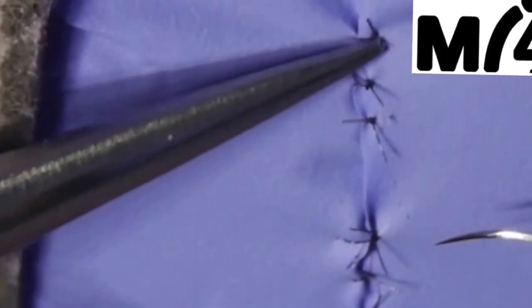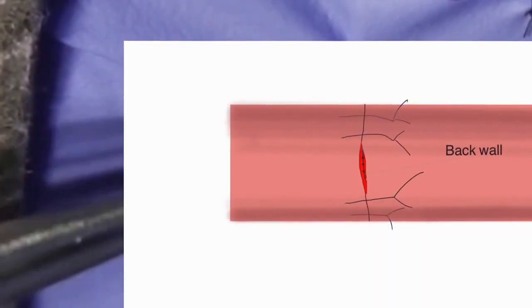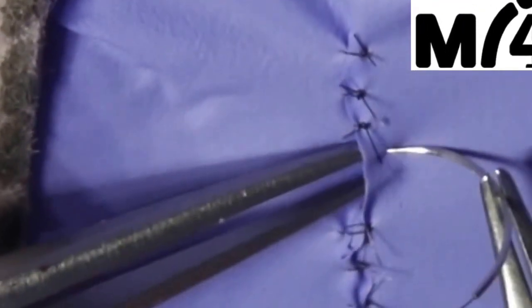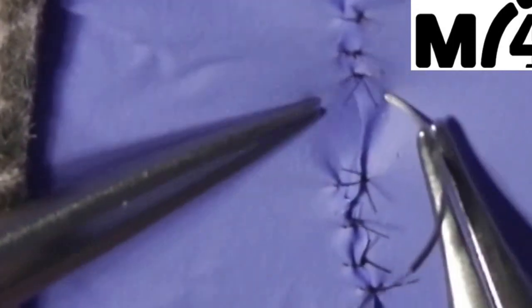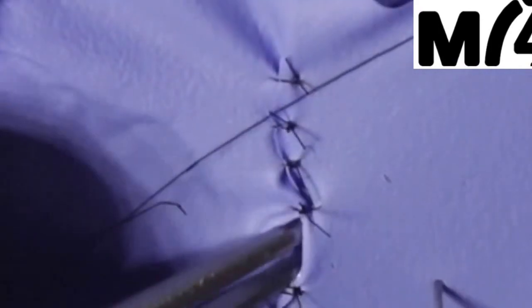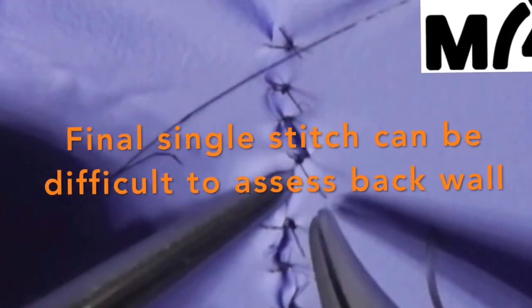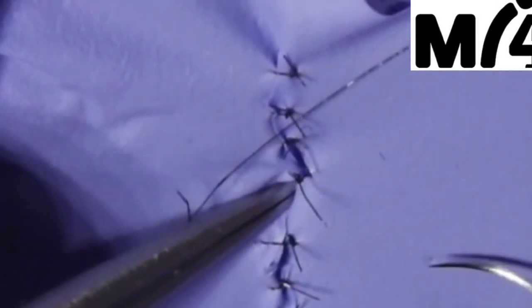You can see here, if you imagine this to be the front wall of your anastomosis, there's just enough space for two sutures. If I pop one suture in, as this gap gets small it can be very difficult to assess the back wall. So you can see my space is very small, and if I'm now going to put in my final stitch it can be very difficult to get in there to lift it.